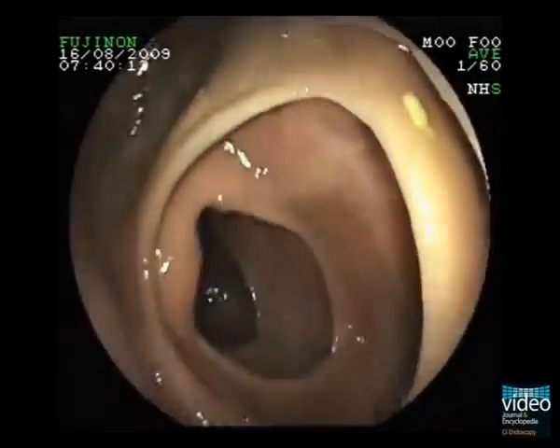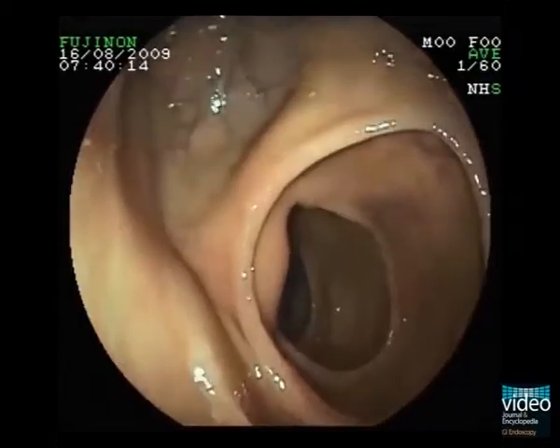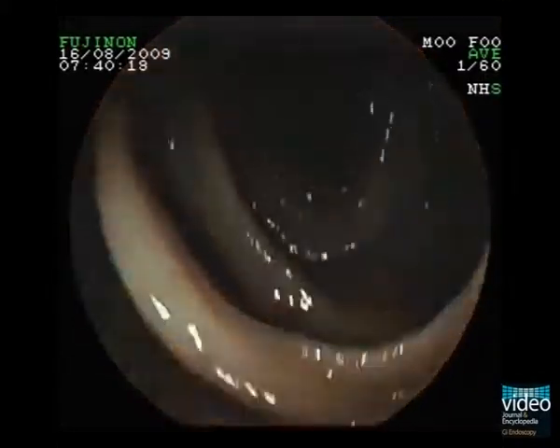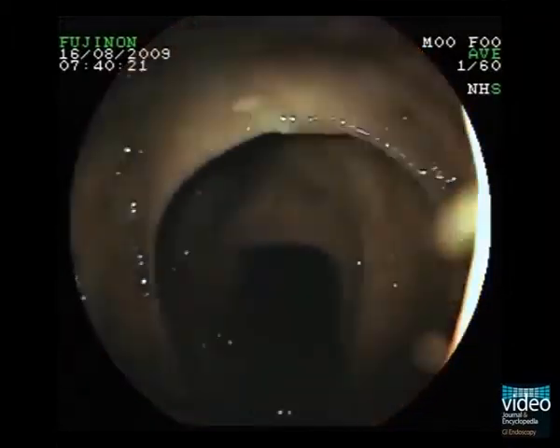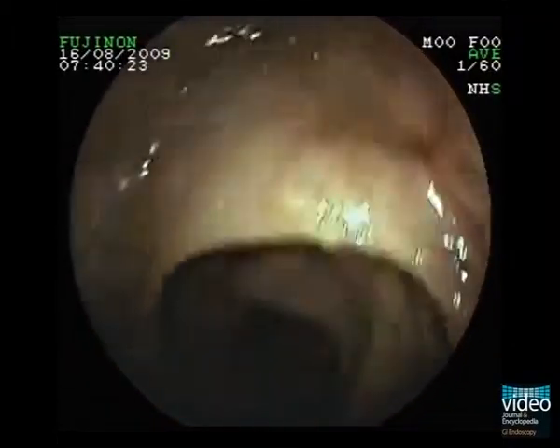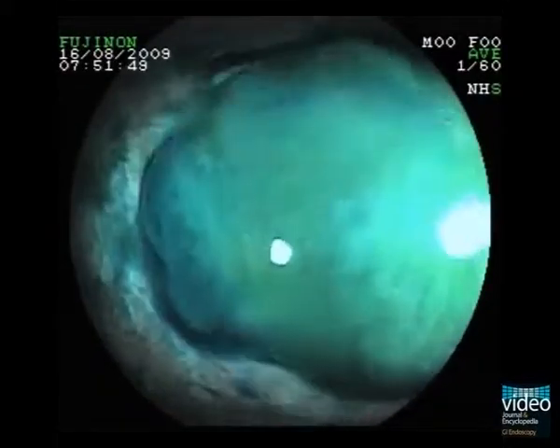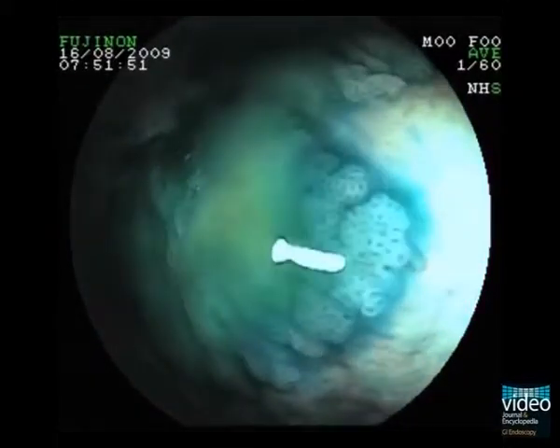Apart from this finding, withdrawal of the endoscope is pretty uneventful. Now we get back to the lesions in the cecum after dye spraying. We see abundant surface mucus and the characteristic pit pattern of serrated lesions — the so-called kudotype 2 pattern with stellate and papillary pits.